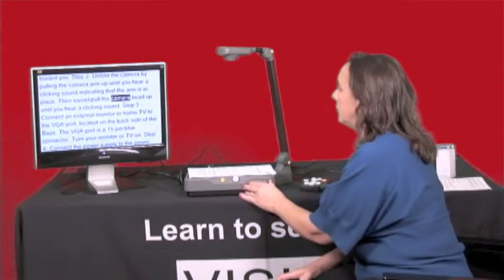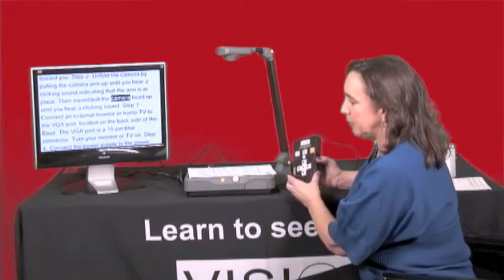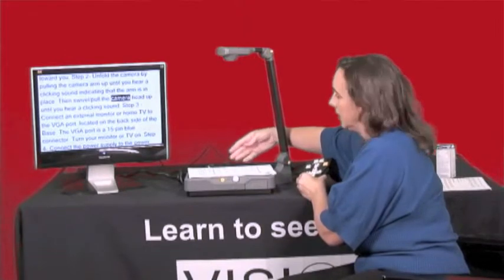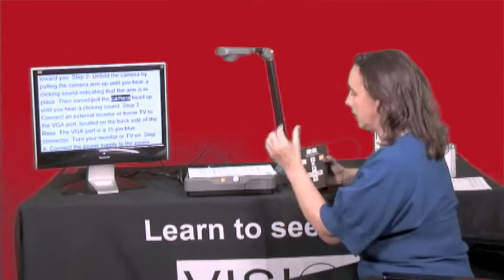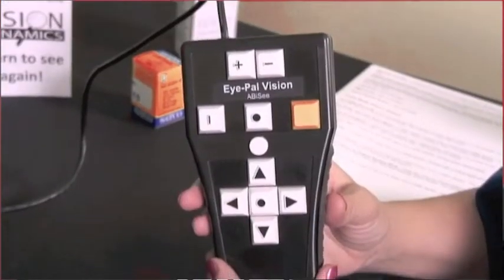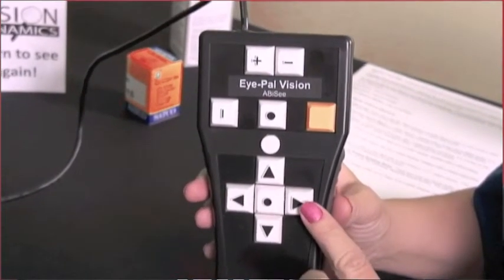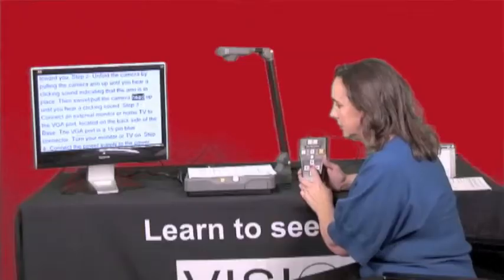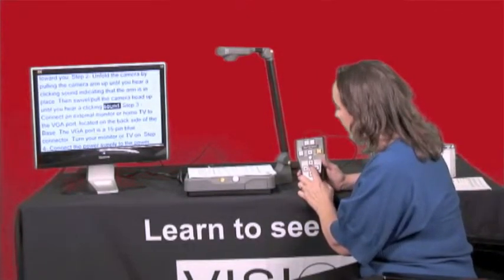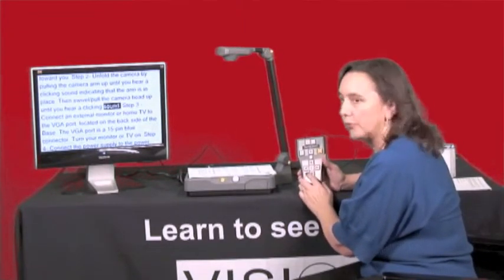Now if you want some extra functions, we're going to move on to the keypad — the remote that we plugged into the flat plug in the back left of the machine. On the bottom part of this keypad there are four arrow buttons, and in the center of those arrows is the pause and start-again feature. It's a square button with a round circle on it in the center of the four arrows.